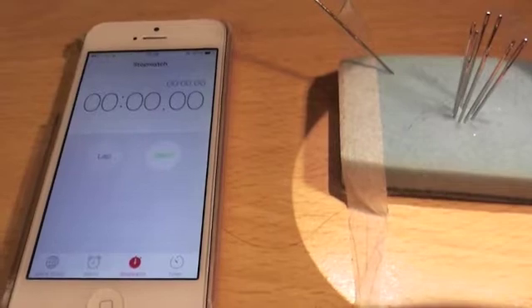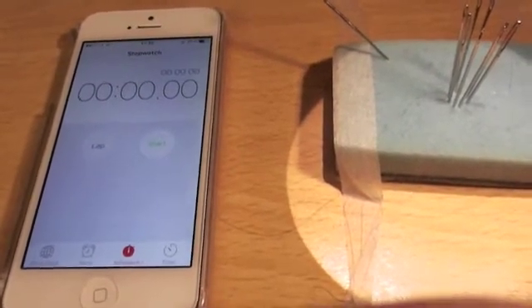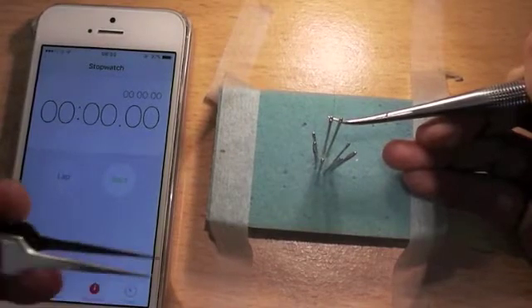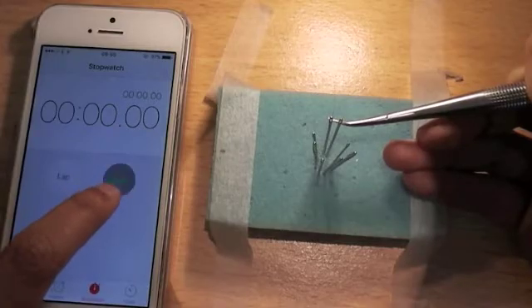First of all, have your mobile phone on stopwatch mode and have it next to your task so you're quick to press start. Before I start my task, I keep my needle loaded and the needle holder about two thirds down the needle. Once I'm in position, I press start and I'm ready to go.